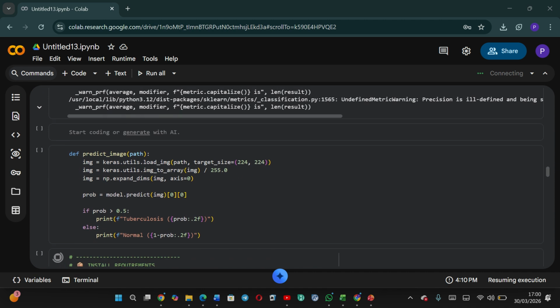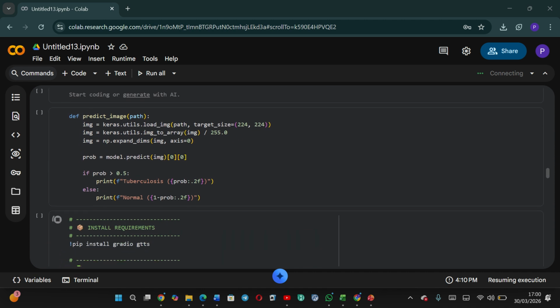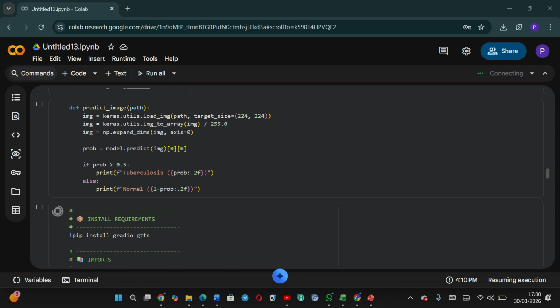Then our next code is a function called predict image. What this function does is load an image, resize and normalize it, and pass it through the model, which outputs whether it's TB or normal, along with the confidence. This makes the model usable in real world scenarios.